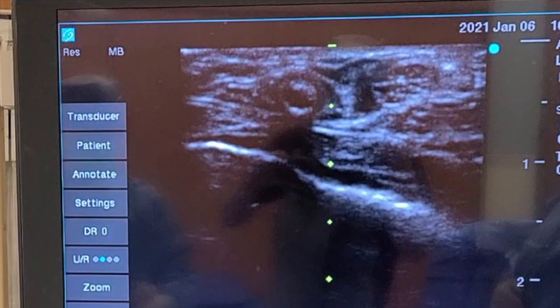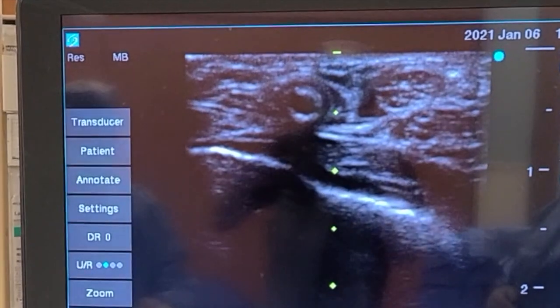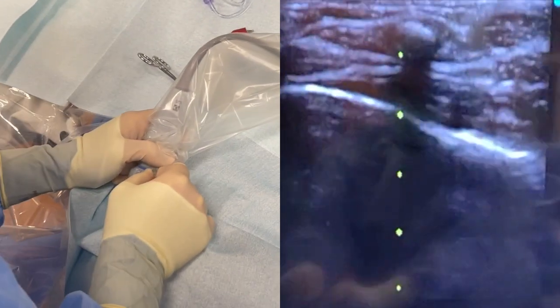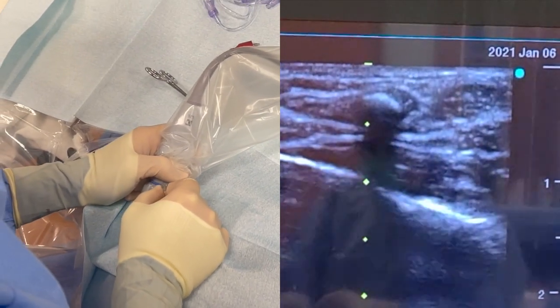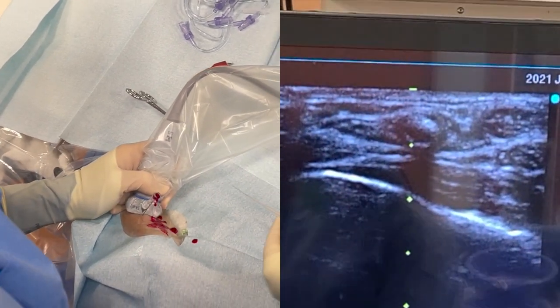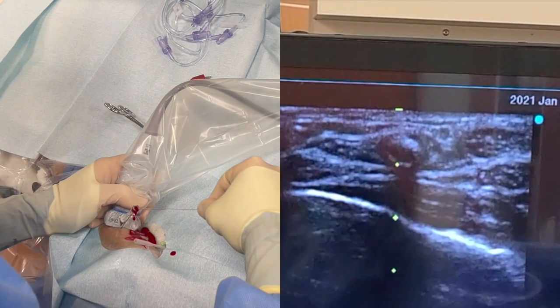And I'm actually having the yellow lines that represent the center of the ultrasound off center a little bit so I can anesthetize around the radial artery without hitting the artery. Although it is often easy to palpate the radial artery and gain access to it, ultrasound can be a very useful tool in increasing your accuracy and decreasing the number of passes with the needle.